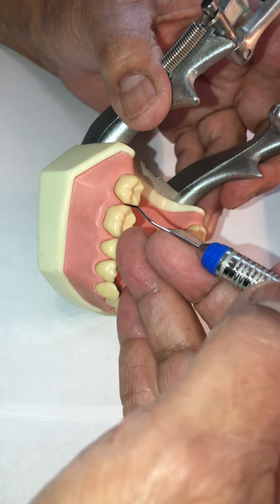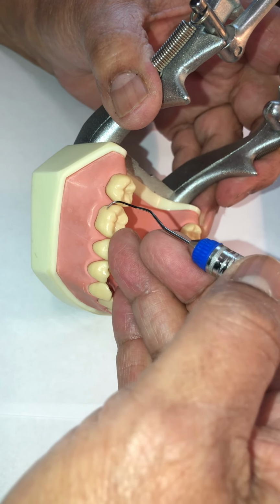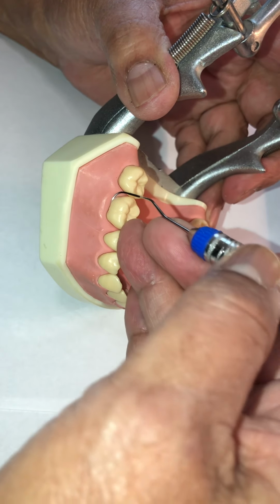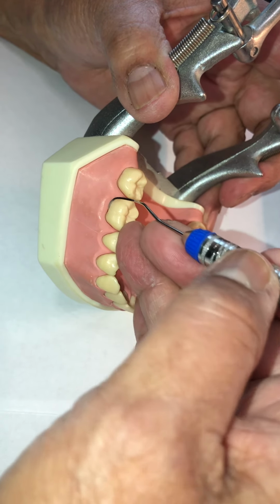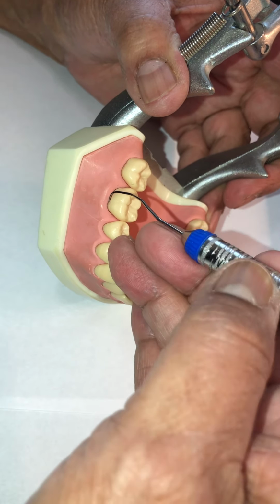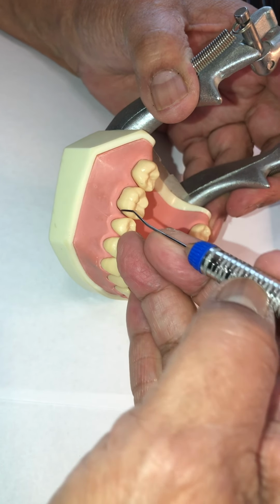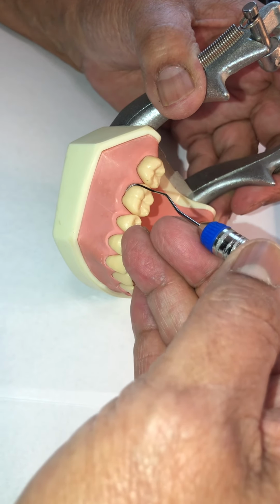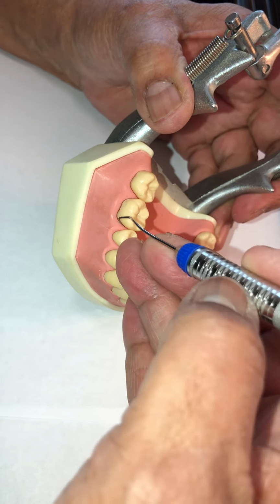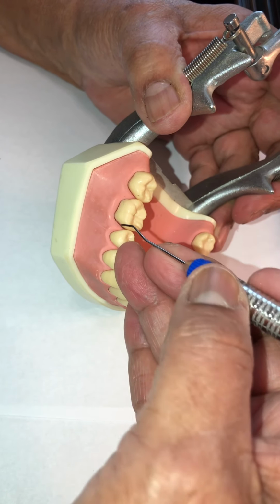Okay, now I'm going to take my instrument, and now I need to go this way. So I'm going to flip my instrument, flip the tip. I'm going to go right back where I started on the line angle, and come around like this. I need to move my fulcrum back. Come around like this, and you see how that working end, because I have the right one, curves perfectly around the roundness of that molar, okay?